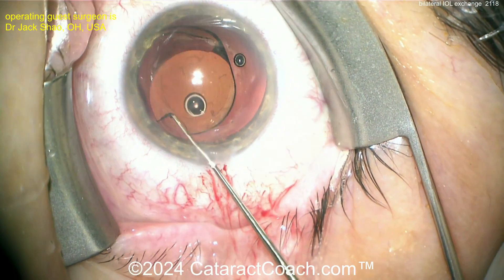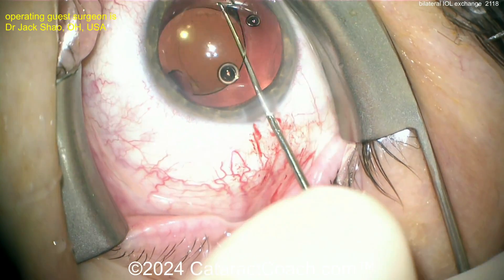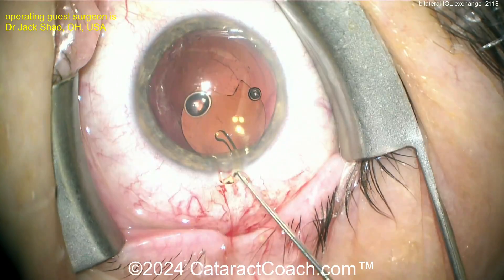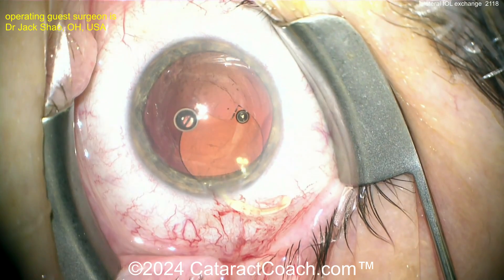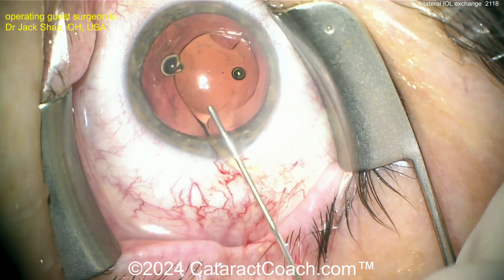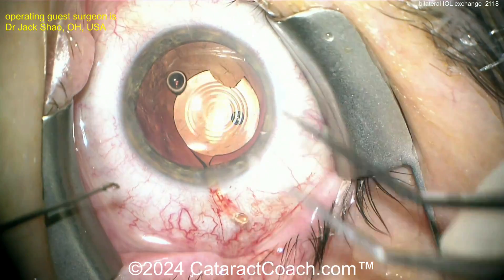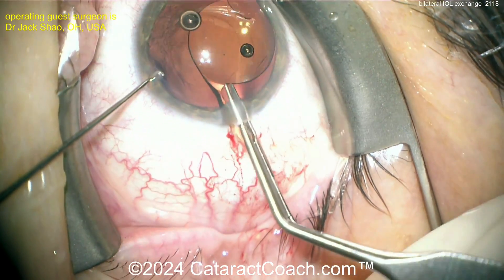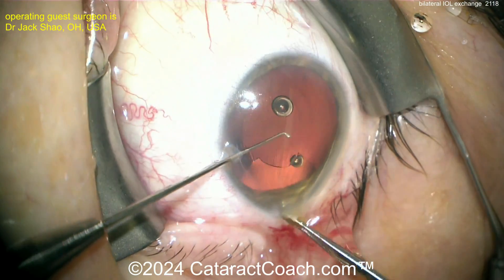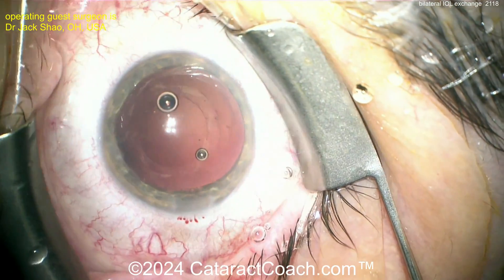The patient will be happy with great image quality for nighttime driving, but may complain they can't see their cell phone without glasses. Some patients just don't understand this trade-off well. Now the lens has been rotated with a little more viscoelastic and the other haptic is brought outside the eye. To avoid complications, I'd really recommend the twisting-out technique — twisting compacts the lens so it comes through the incision more easily. But yanking works too.